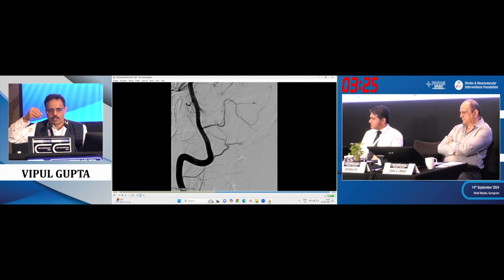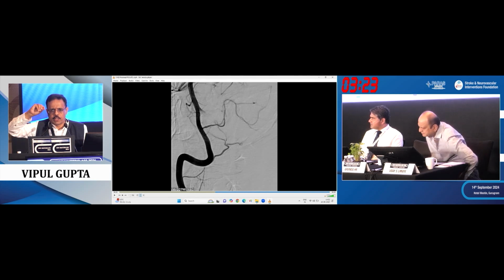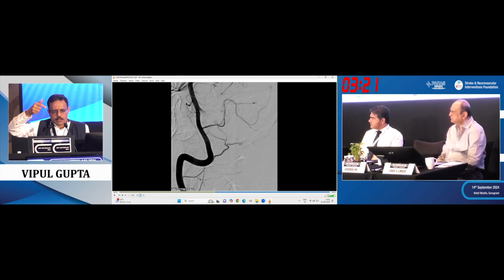We love Synchro while we give it a super duper curve as much as we can make it into a pigtail. And then somehow it tracks well and slowly, but it was quite like a treadmill test to cross that aneurysm. So that's why in between the case we prepared a balloon and placed it. Worst comes to worst, we rupture, we inflate the balloon and close the artery and get out of it.